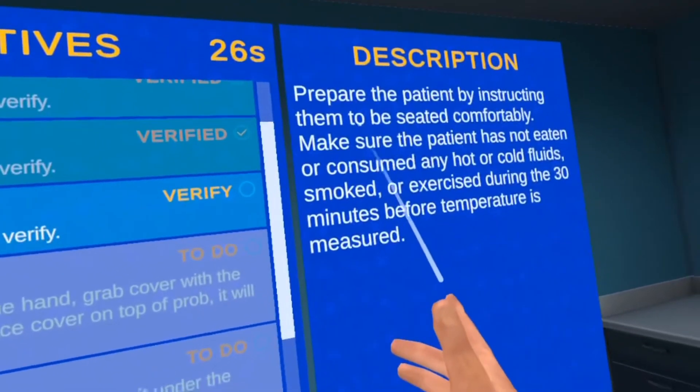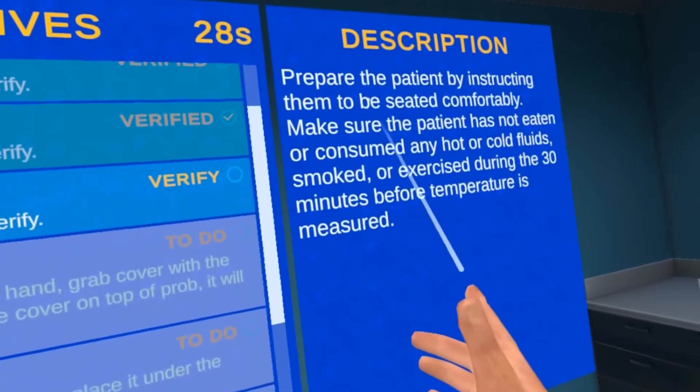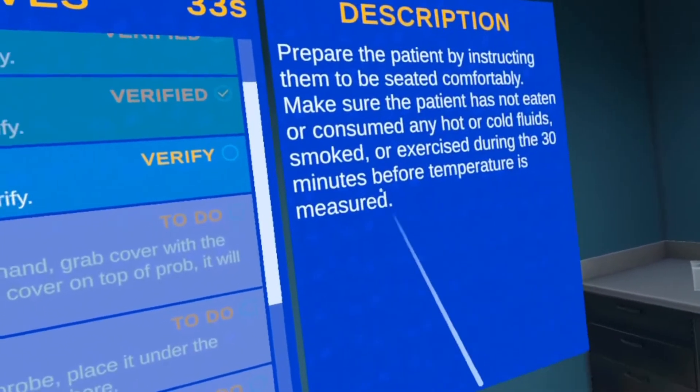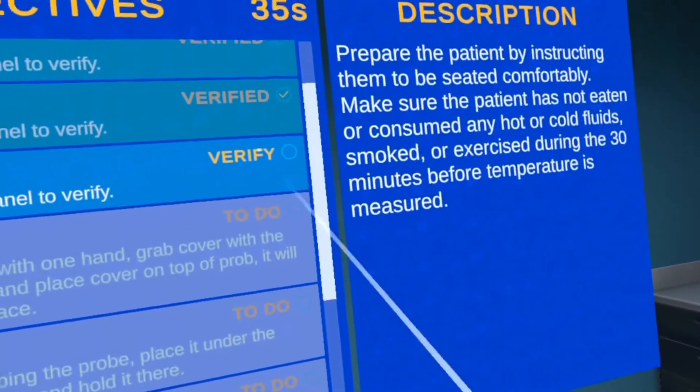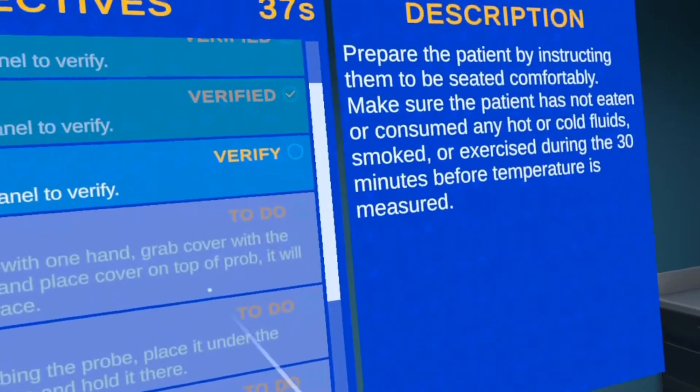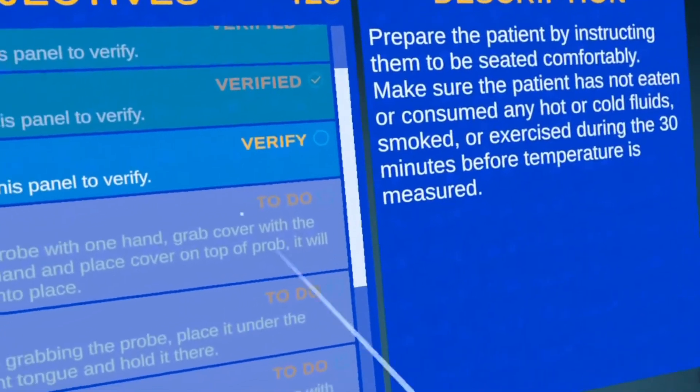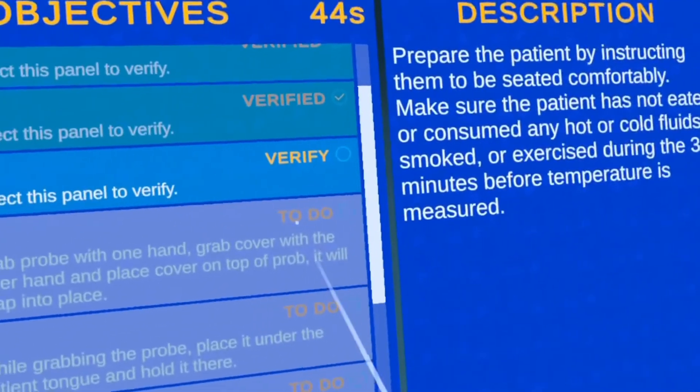The main thing here is you want to make sure the patient hasn't eaten or consumed any hot or cold fluids, smoked, or exercised during the 30 minutes before temperature is measured. If they have, you'll get a false reading — a higher or lower temperature — and it won't be accurate. So that's very important to ask the patient before doing anything.